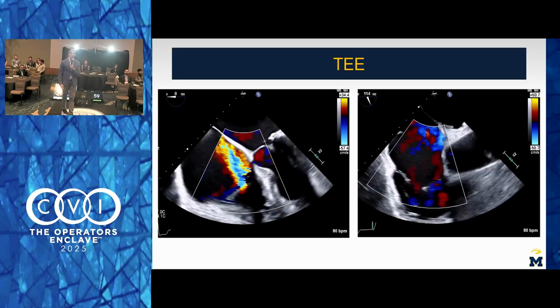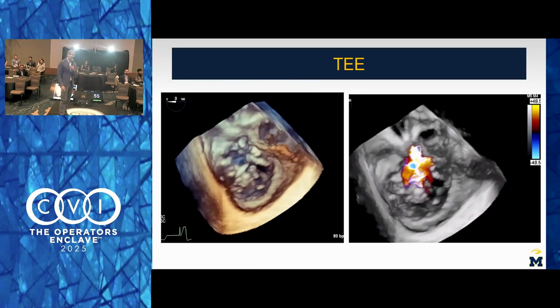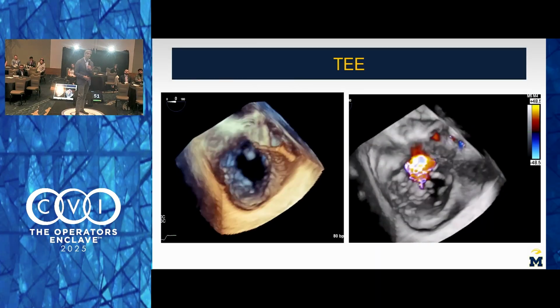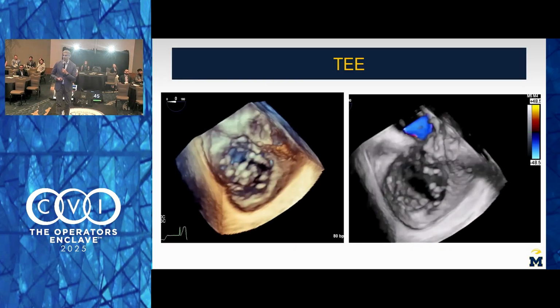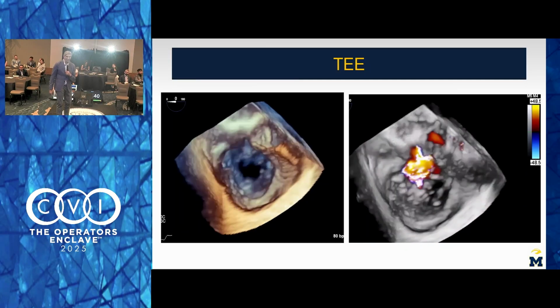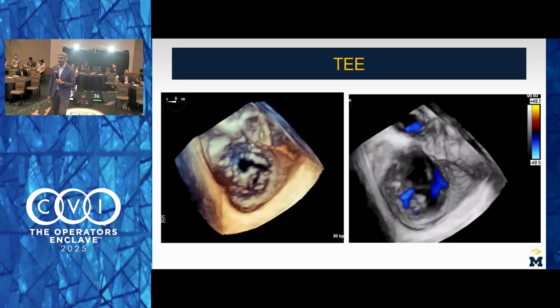And so some of the other images I didn't keep in here, and I'll show you the 3D, but some of the other sizing, he got a TTVR CT protocol. His annulus dimension was 6.2, and his perimeter was 199. So would that be eligible for any of the new things that you're talking about? No. Okay. Say it again. Out of range for everything?